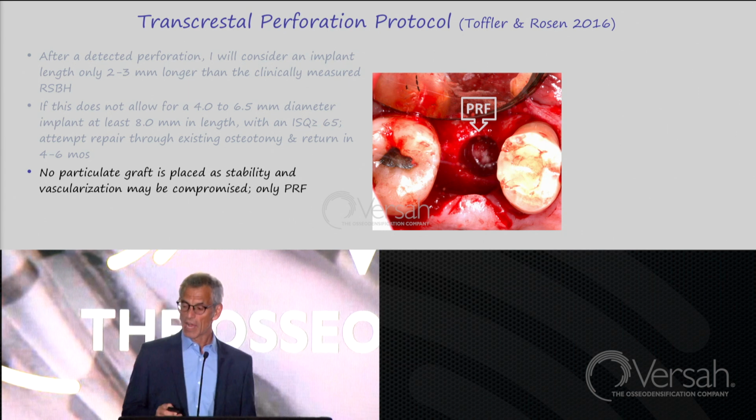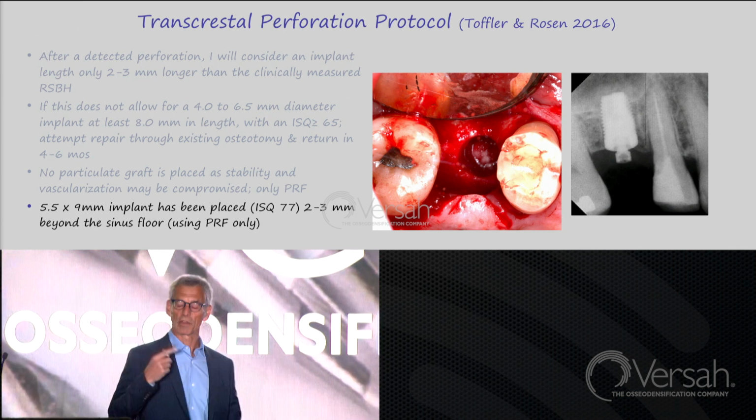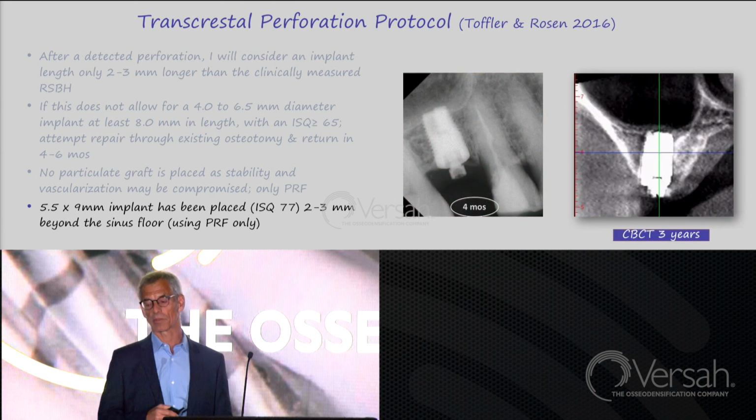And here, I follow my guidelines and I place a 5.5 by 9 millimeter implant with a high ISQ reading 2 to 3 millimeters beyond the floor. And it heals at 4 months and it heals at 3 years.